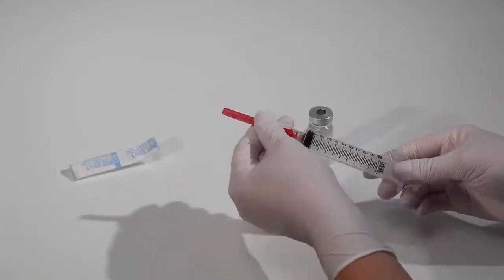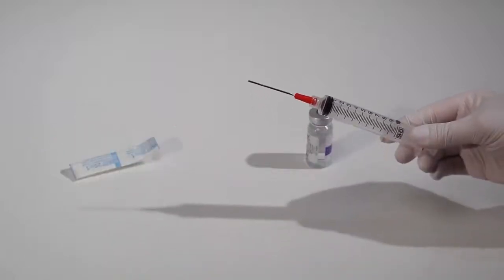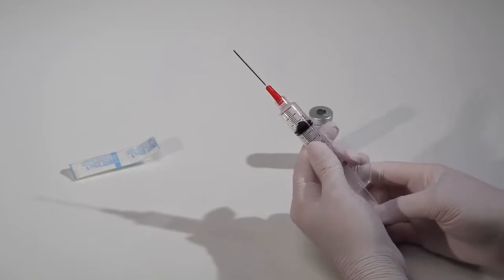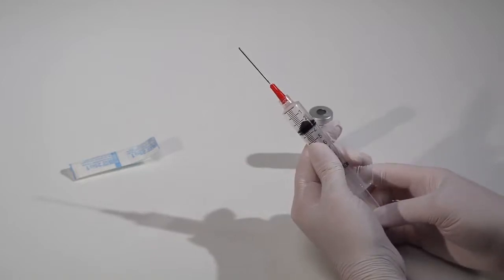Remove the needle shield from the blunt fill needle. Now, draw into the syringe a volume of air equal to the amount of medication or fluid needed. Be careful to avoid touching the needle on any surface to maintain its sterility.